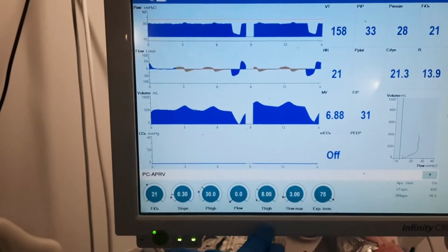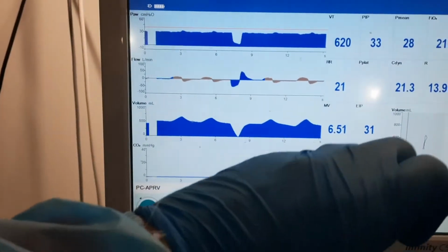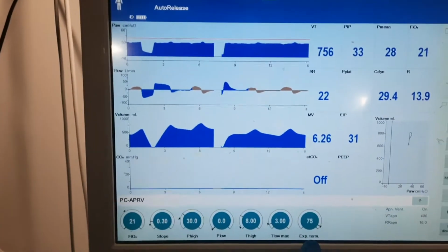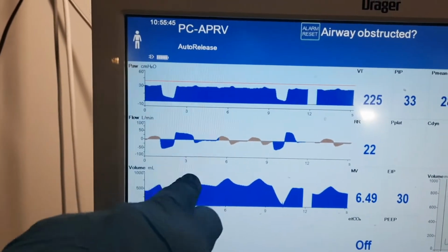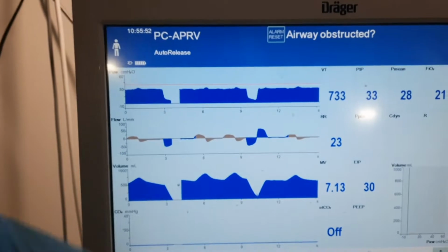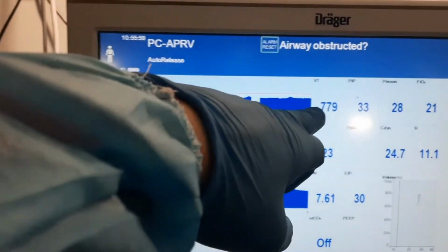We can't get that otherwise. And we're trapping 75% of the peak expiratory flow during the releases, and the science so far behind it is that we can recruit with pressure over time, and we prevent de-recruitment by such a brief release, trapping 75% of the peak expiratory flow, and that keeps the alveoli that are now getting recruited from collapsing.